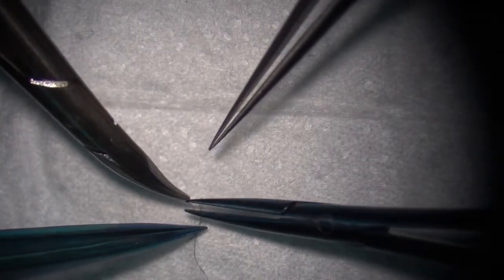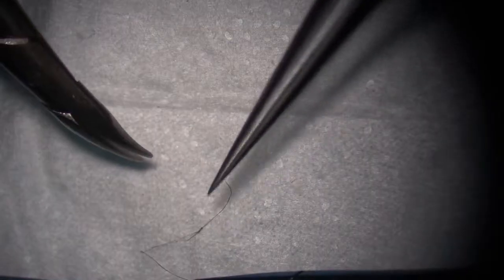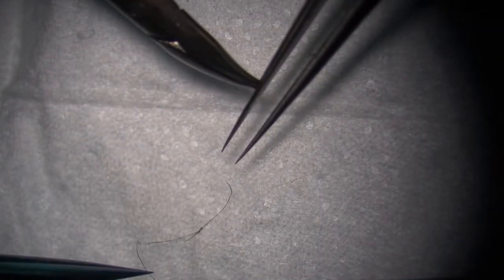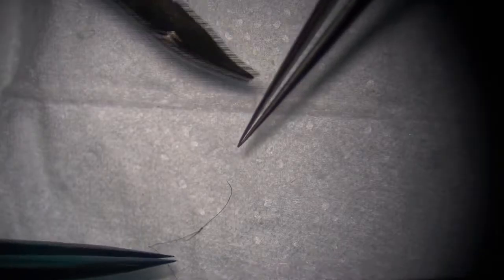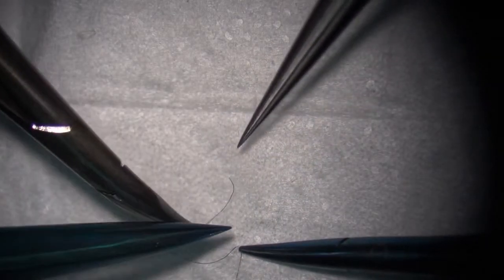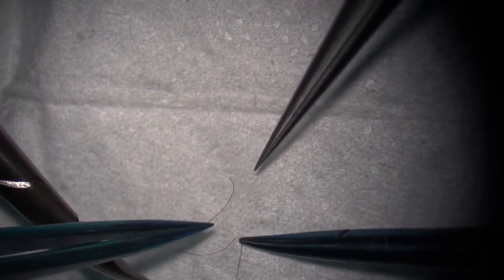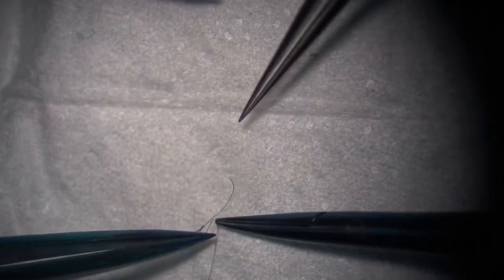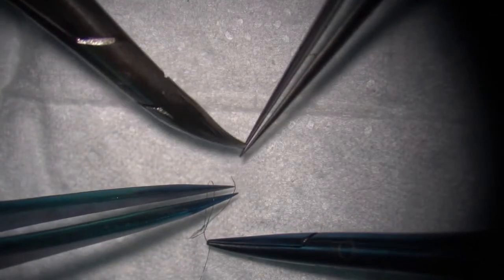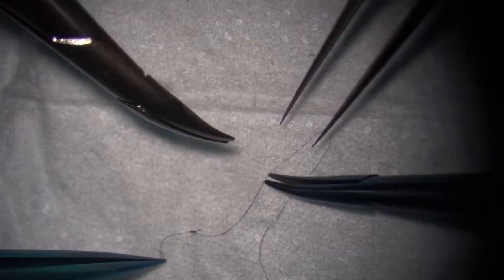Oh, this is straight up. Yeah, a little bit longer. And nice. Okay, now hold on. Now the forceps position is important. Like if we put it in here, it's outside. Yeah, the forceps should be in between these two sutures. Between the two. So if it's here, it's outside of the two sutures. So I would loop it here, very close to the short end. And I'm not going to pull too much tension.